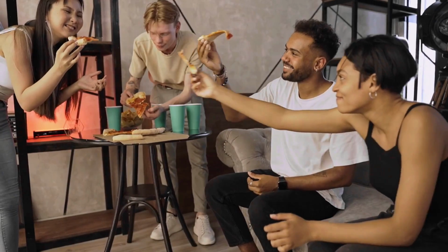When you have Invisalign, they promote you actually can eat whatever you want, whenever you want. But you need to take them off before every meal. If you're going to drink anything, it should be water or a clear liquid. You don't want to stain or damage the trays, but also anything you eat or drink that gets stuck in your tray can damage your teeth.